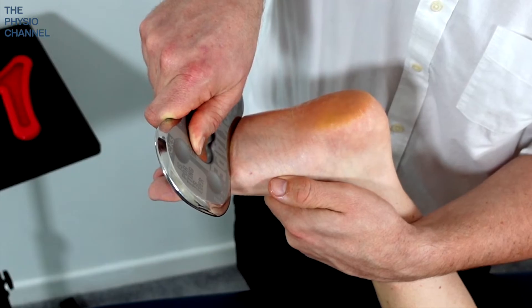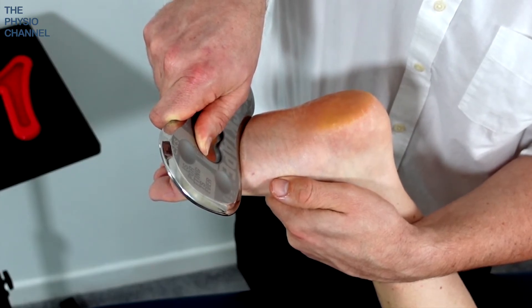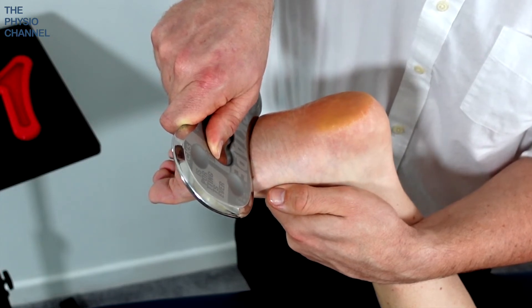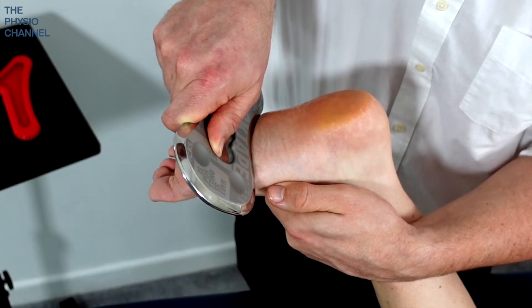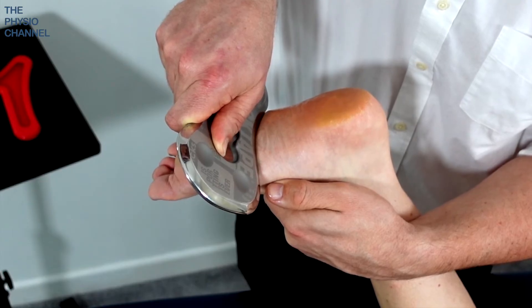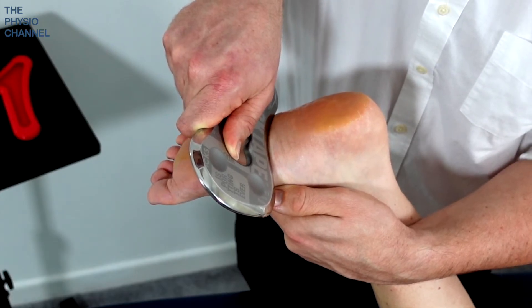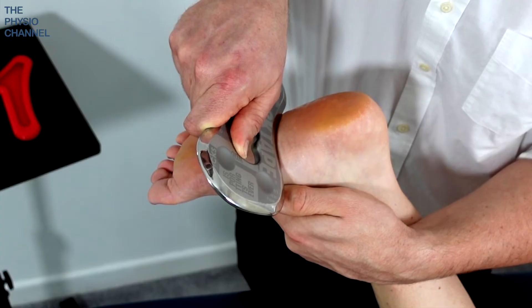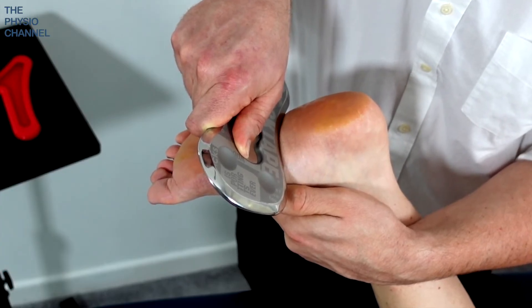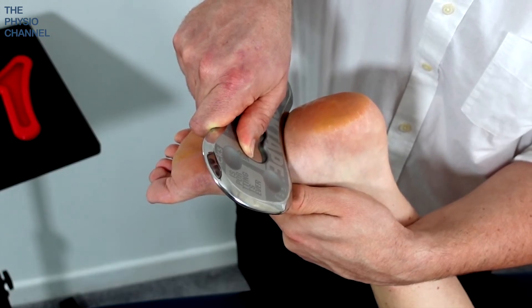You can see I've got a firm grip over the tool and I'm moving the tool slowly through the sole of the foot with a light to moderate pressure. Using a light to moderate pressure and moving slowly makes sure that it doesn't cause the patient any pain or discomfort. If it does, then I would use less pressure or move the tool slower over the treatment area.